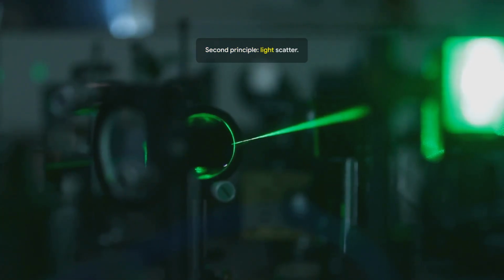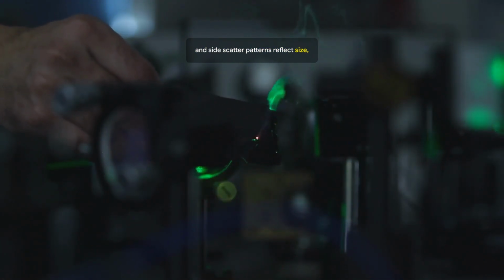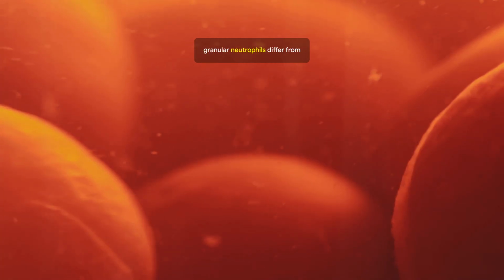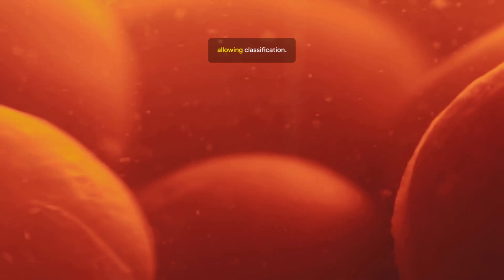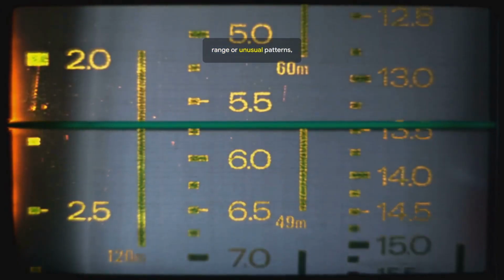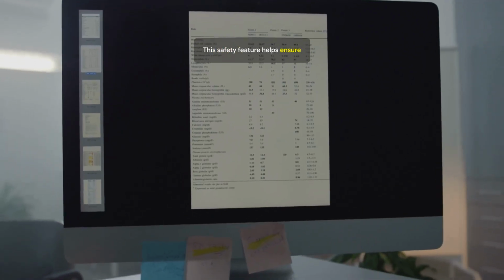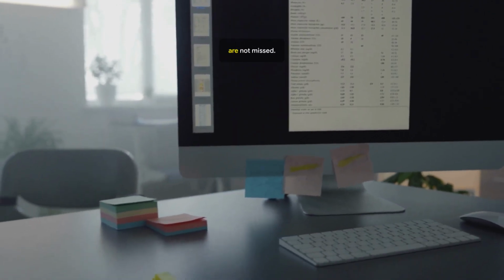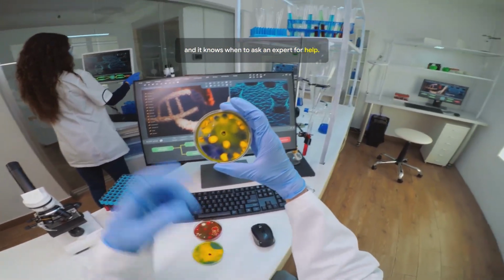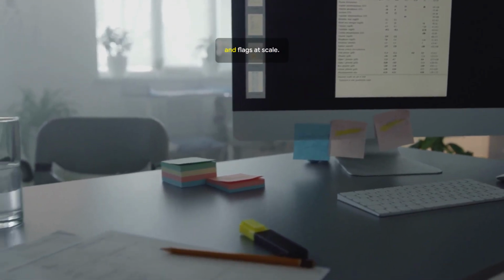Second principle, light scatter. A laser beam hits each cell. Forward and side scatter patterns reflect size, shape, and internal complexity. For example, granular neutrophils differ from smoother lymphocytes, allowing classification. Analyzers also flag results outside range or unusual patterns, pausing samples for human review when needed. This safety feature helps ensure serious abnormalities like leukemia are not missed. The machine does the high-volume work, and it knows when to ask an expert for help. Together, impedance and scatter produce reliable counts, differentials, and flags at scale.